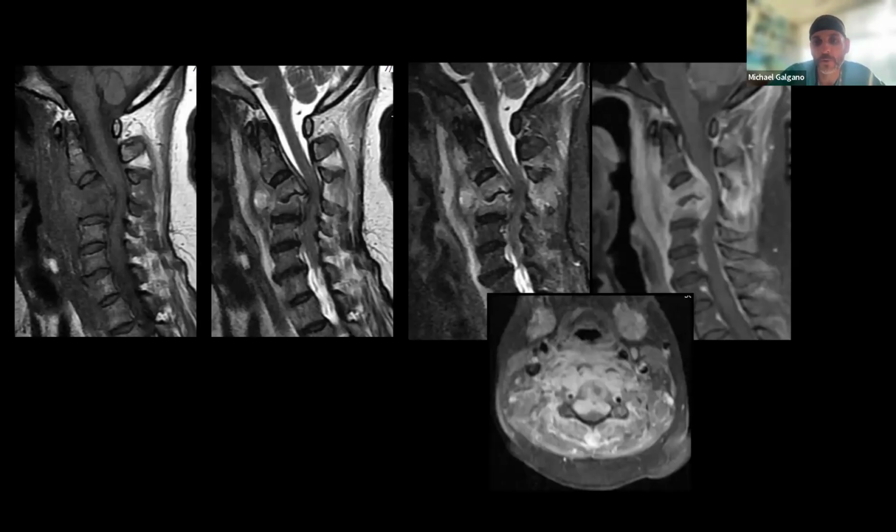But my suspicion is that most of what we're looking at here in the far right image, I think that's just all a thick rind of phlegmonous tissue. And it's actually very difficult to take off the dura. If it's an abscess, once you get into that pocket, it just egresses out, right? But something like this, it's not so easy to take off the dura sometimes.